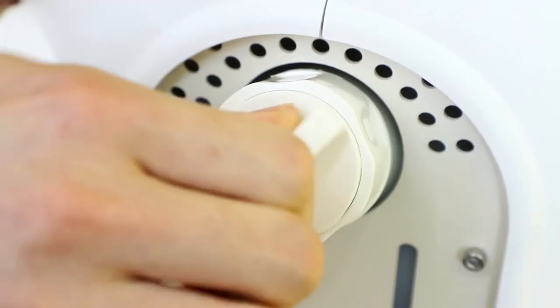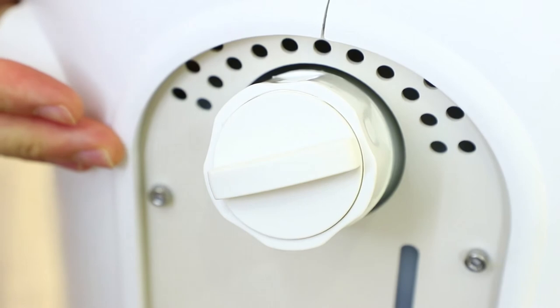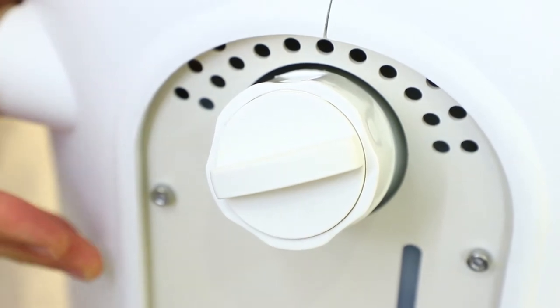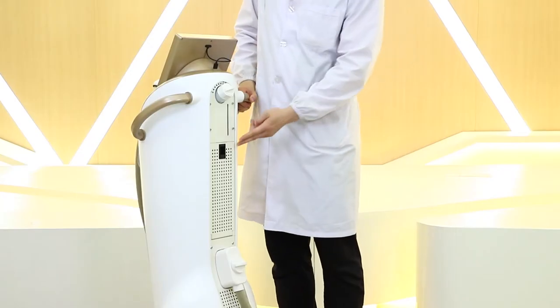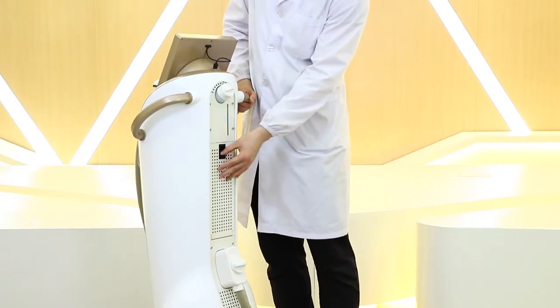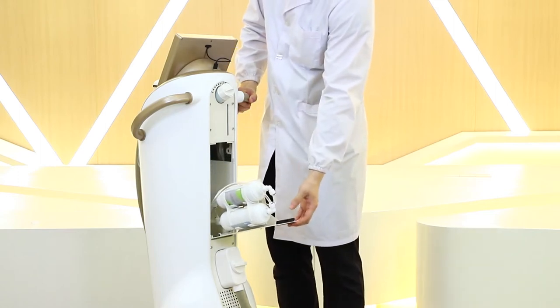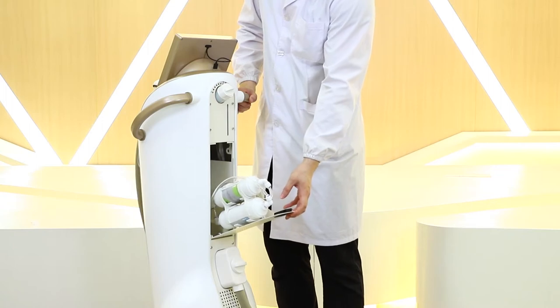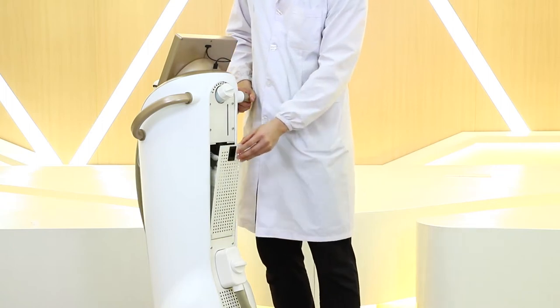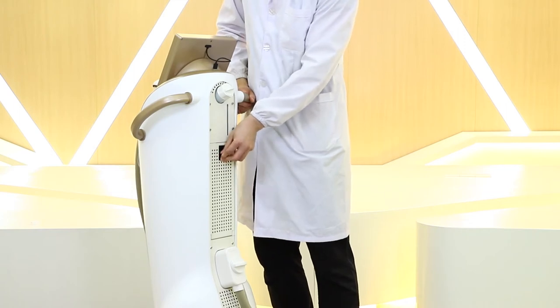If it is the first time we use the machine, because the water pipe inside is also empty, we must add water again. As we press this button, we can see the water filter. We suggest changing this water filter every half a year. If the interface shows a bad water quality warning, we should also change the water filter.